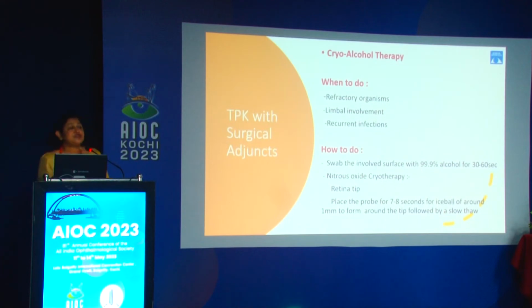Now, if you have a patient with a refractory organism like pythium keratitis, or you have a limbal involvement, or you have patients presenting to you with a recurrent infection following a therapeutic graft, what we usually advise is a TPK with surgical adjuncts, that is a cryo-alcohol therapy.